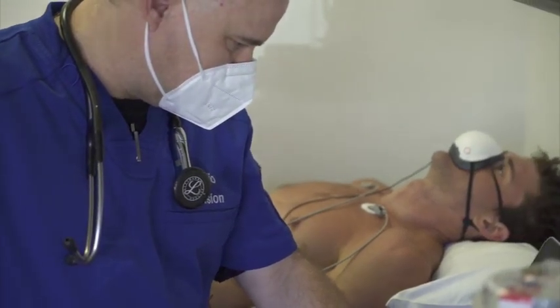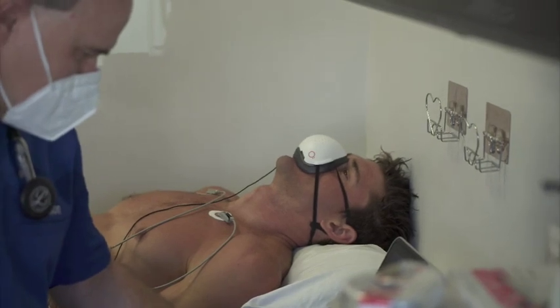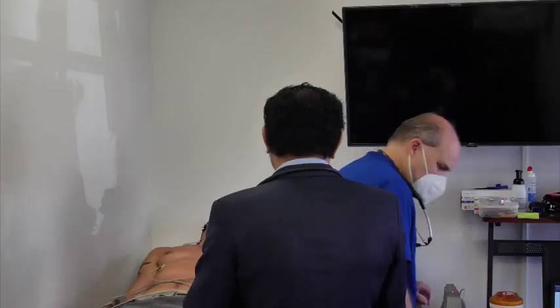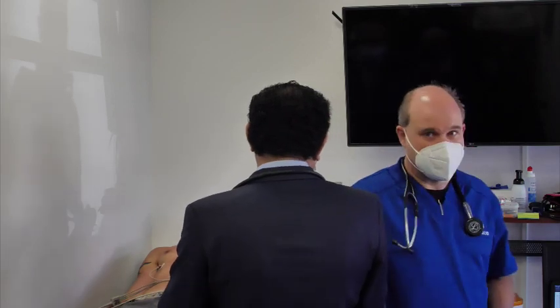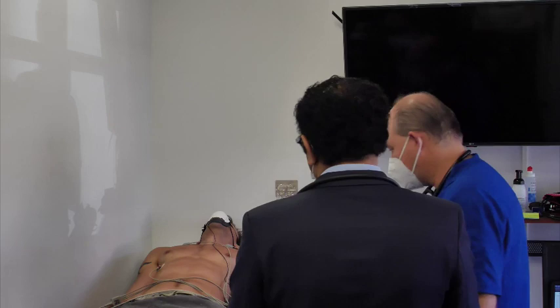Some of this is a little technical, but we can walk through it. It wouldn't be surprising to see some thickening of the walls — what we call hypertrophy, concentric hypertrophy. But there will be some patterns that we can look at to tell if this is abnormal or not.